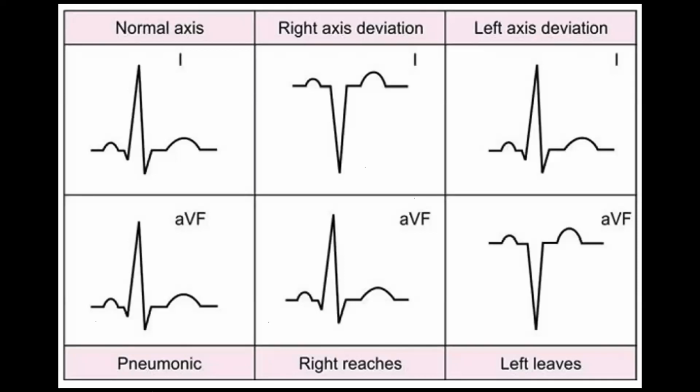The axis deviation can be useful for lots of conditions just to be aware of, and there's a long list of causes of them, which I'm not going to touch upon today, but you can have a look at those and understand those.